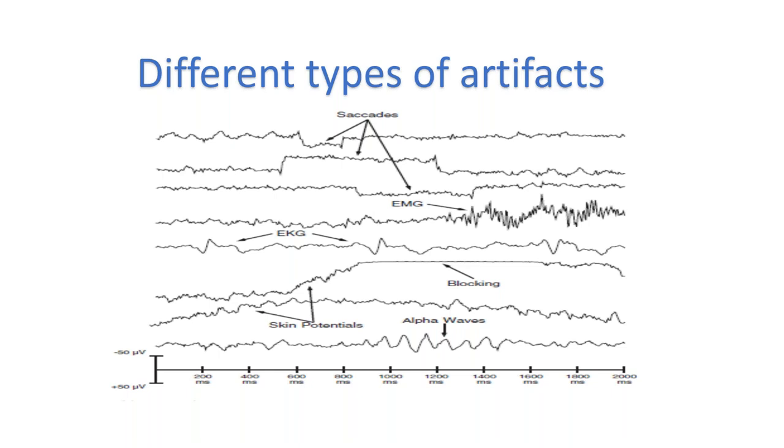Hi, Vanaja. That was a great presentation. And this slide also is the right thing. I had a question on these alpha waves. What is the amplitude of these alpha waves?